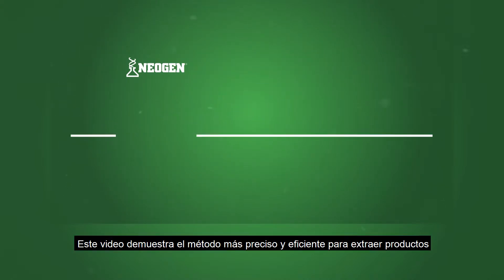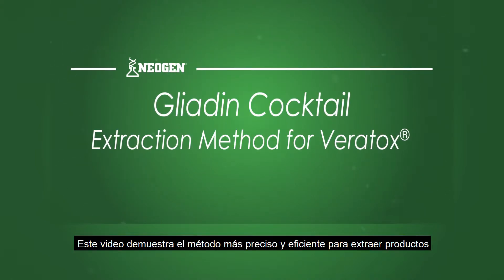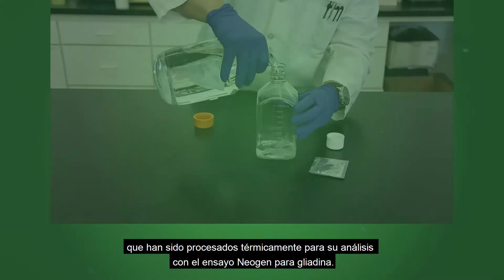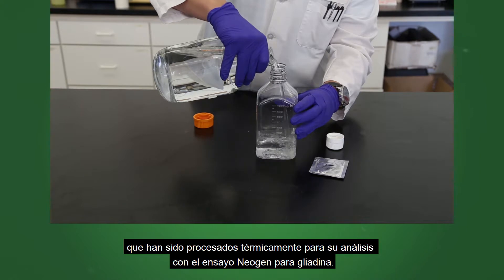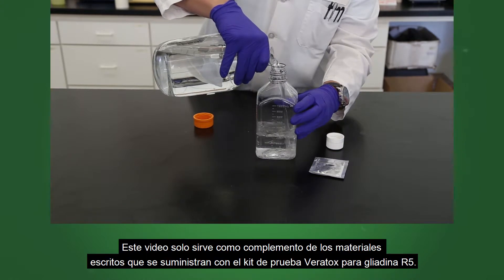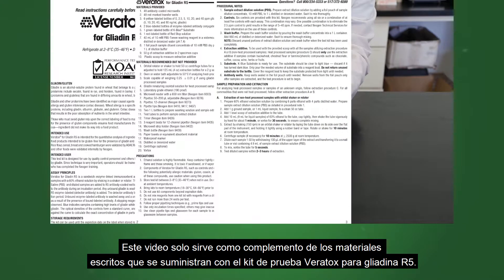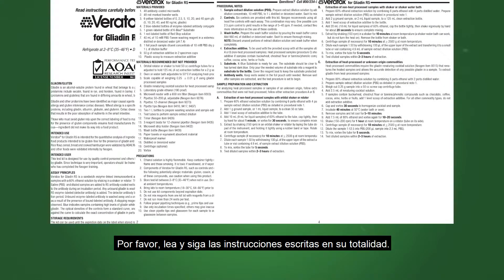This video demonstrates the most accurate and efficient method of extracting commodities that have been heat processed for analysis on Neogen's Gliadin R5 assay. This video serves only as a companion to the written materials supplied with the Veritox for Gliadin R5 test kits — please read and follow the written instructions in their entirety.